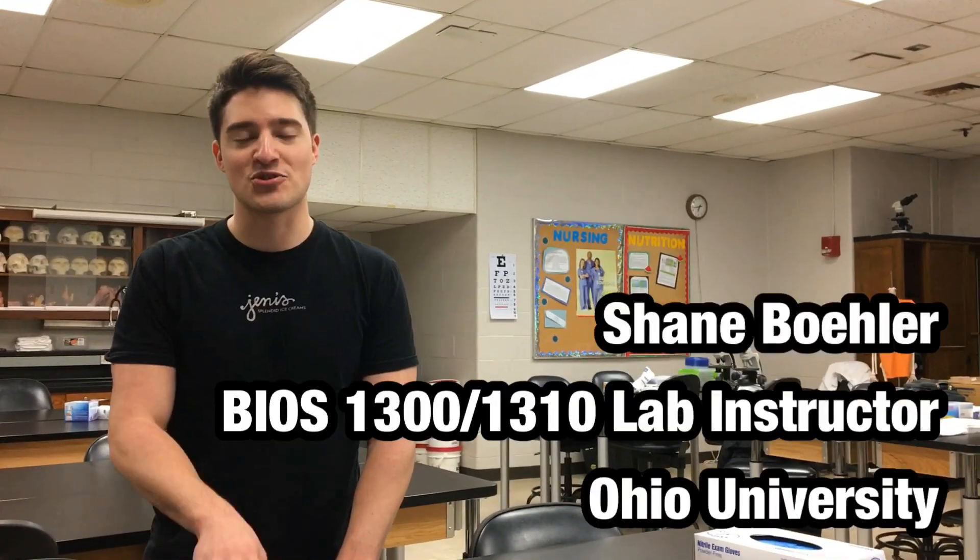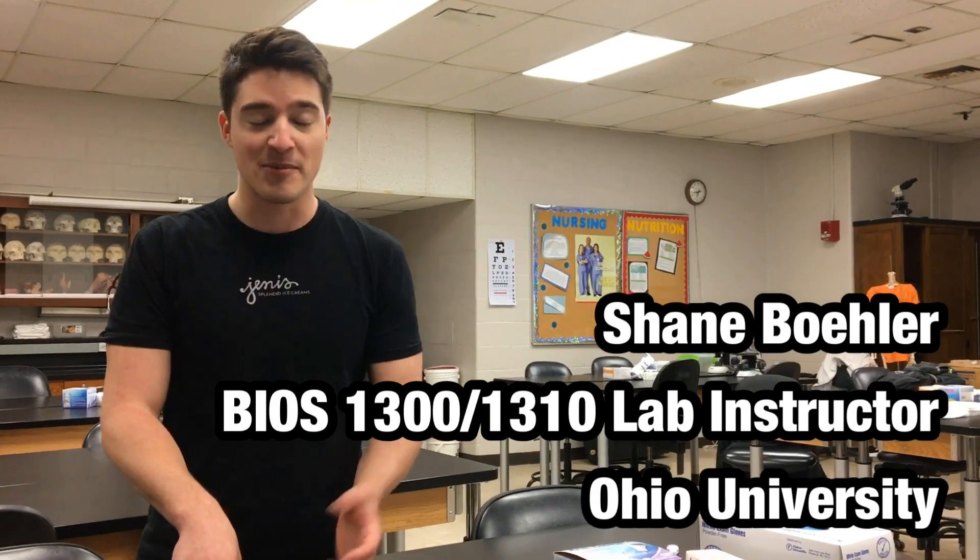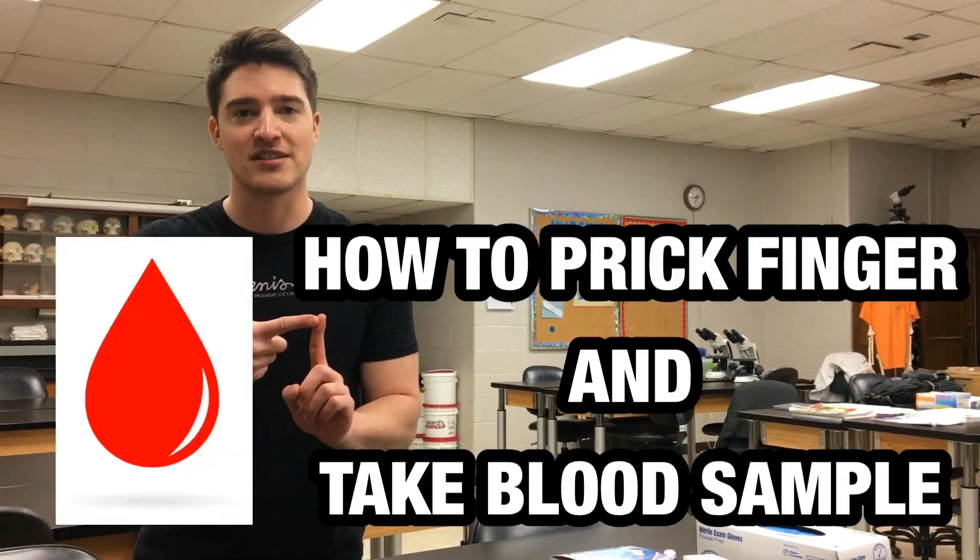All right, hello everyone. My name is Shane. I'm an instructor here in Ohio University's Human Anatomy and Physiology Lab. I'm going to show you how to go ahead and prick your finger and take a blood sample.